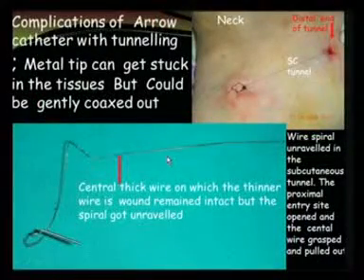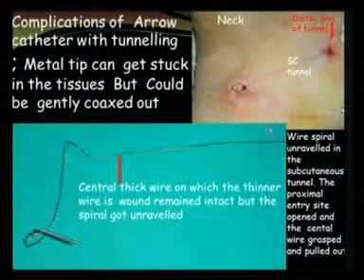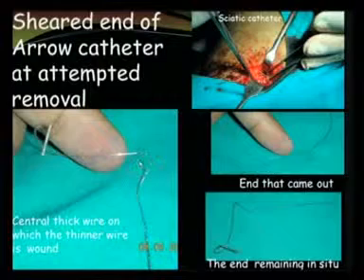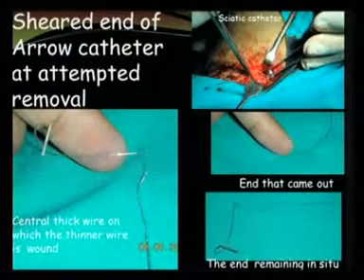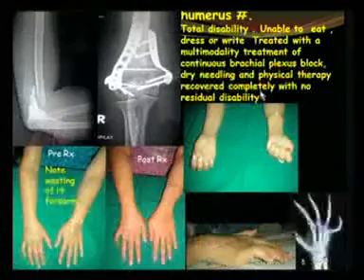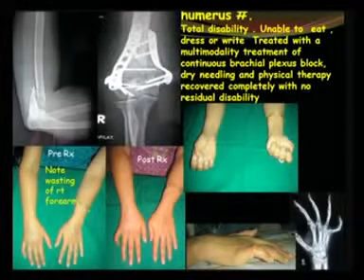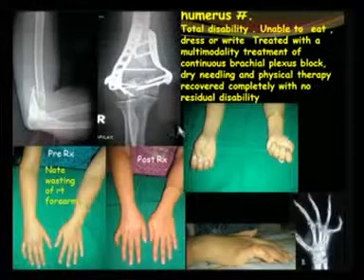But then, as I was mentioning with AORA, sometimes it can snag in the tissues and you really have to tug at it. In 2 patients I have had this complication. I showed you the first complication, and in another patient, it snagged so much that the plastic wire came out, but not the metal wire, which had to be taken out later. After this, I have decided that it's not worth it, so I usually go for Payung, which has a wire inside the catheter.